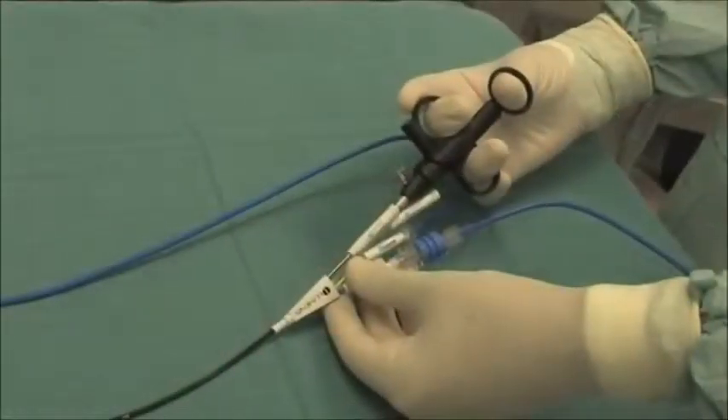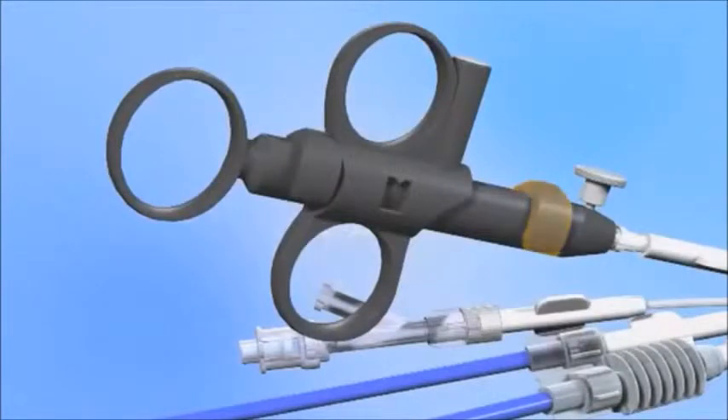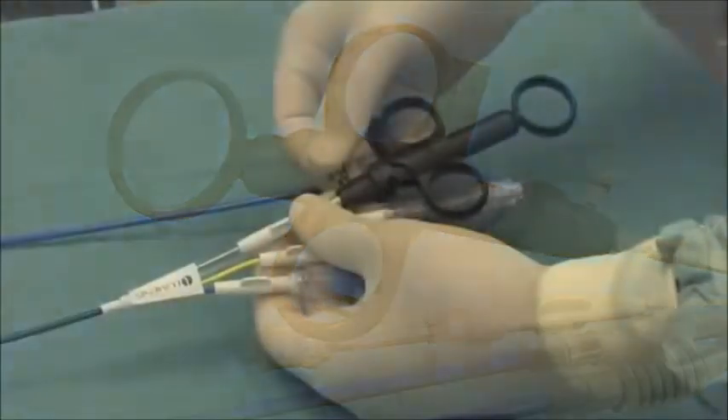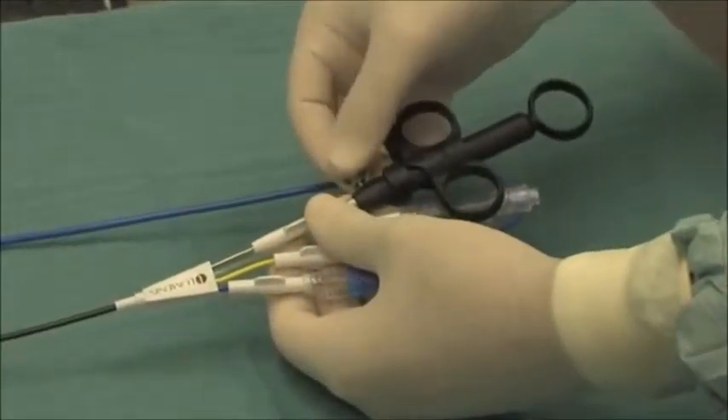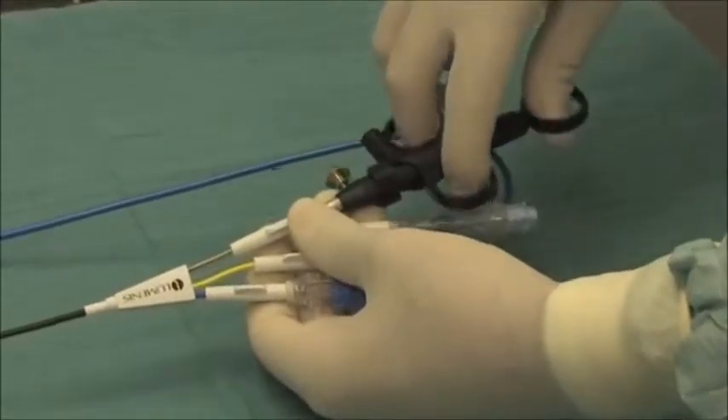The catheter handle offers simple control over catheter direction. The handle includes an adjustable stop to block the catheter bend if desired. A rotation feature on the handle allows the bend of the catheter to be orientated in any direction.